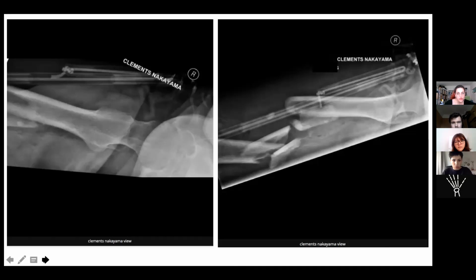So what do you see? Can someone tell me what kind of fracture it is? The expert will speak herself. Yes, that would be a segmental fracture and a compound fracture as well. And I suppose you would first go about trying to align the bone again with the fracture. Yeah, we will get to that soon.